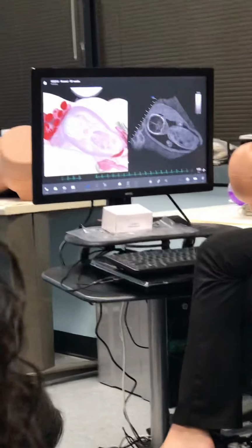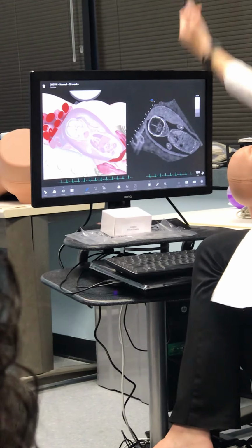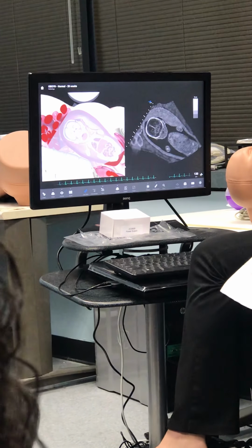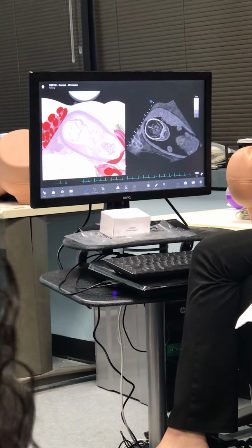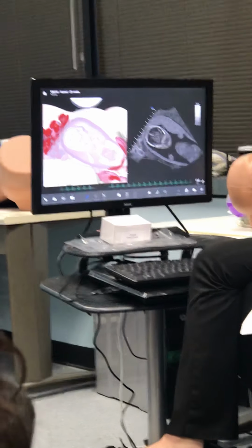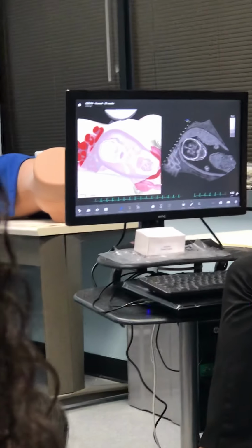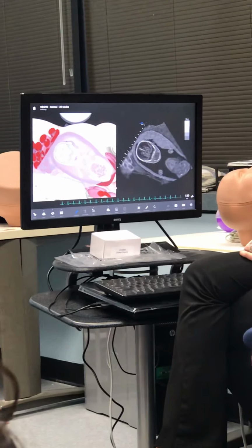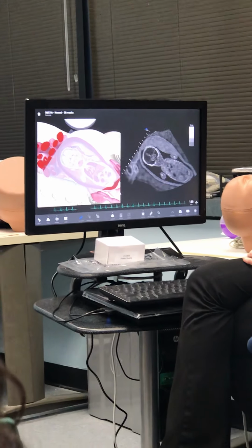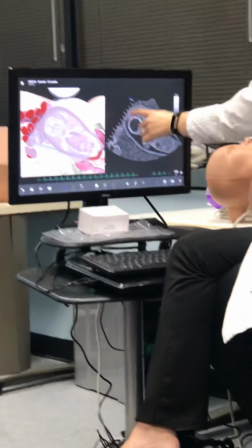This particular placenta is going to be anterior, right? Because anterior is top, posterior is bottom. Generally, this is something that's pretty easy to determine. When you plop down the transducer, if you can see the placenta up at the top, that will be what we call anterior. If you plop down the transducer and you see placenta on the bottom, that's going to be a posterior placenta. Okay? And then as far as this one, it's kind of anterior fundalish. Because here's the fundus of my uterus, and you see how we have placenta kind of touching the fundus.